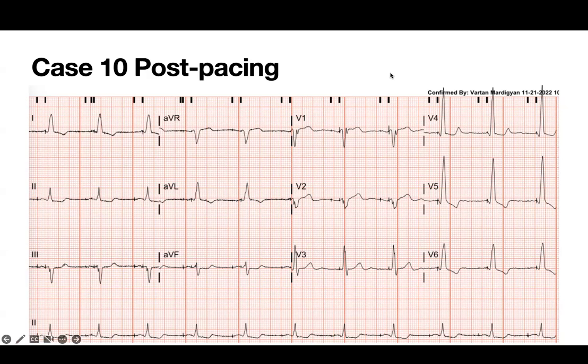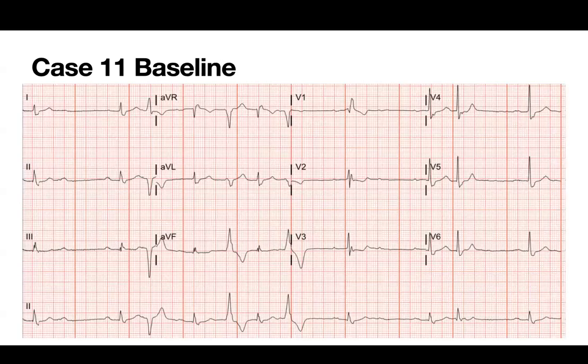Go next. Yeah, I don't think you can get better. I think the muscle is the issue here, not the conduction system. I actually don't think your LVAT is that bad on those ones. Oh, this is beautiful. Visually, I thought it was like 80 milliseconds. No, I mean, it's really 110.